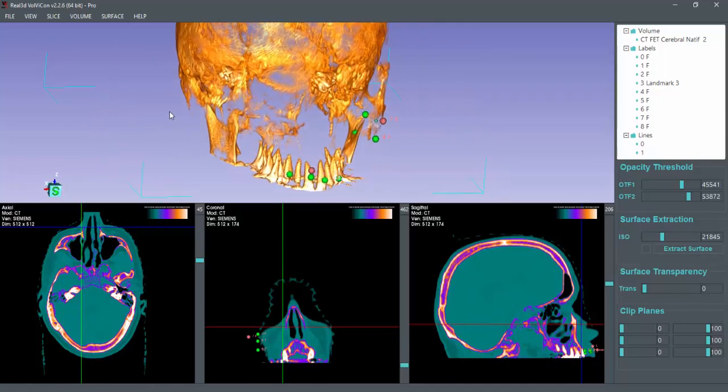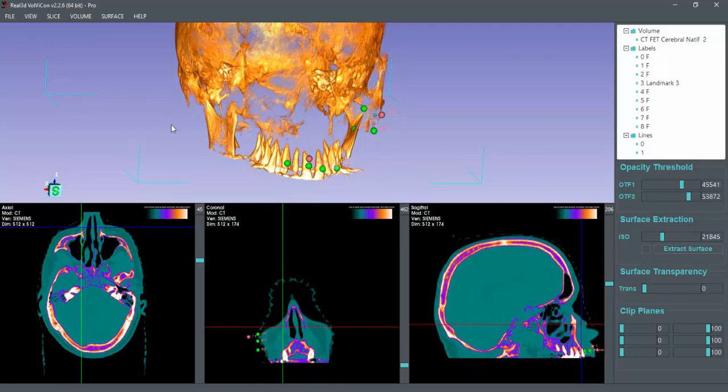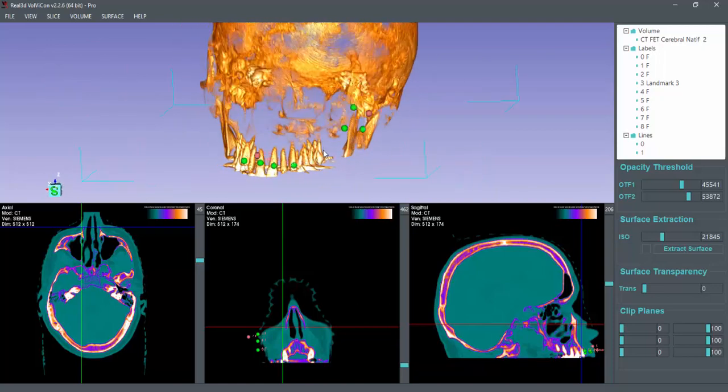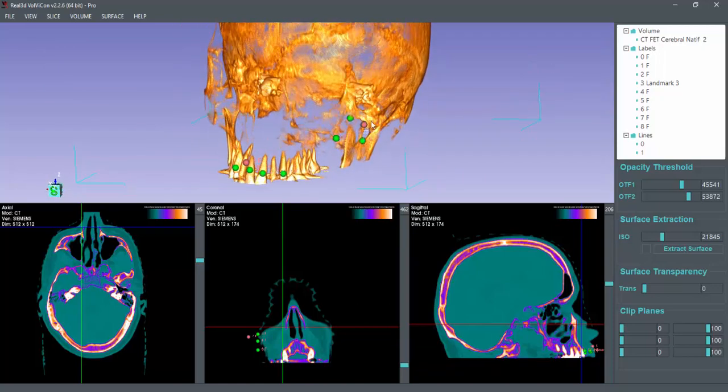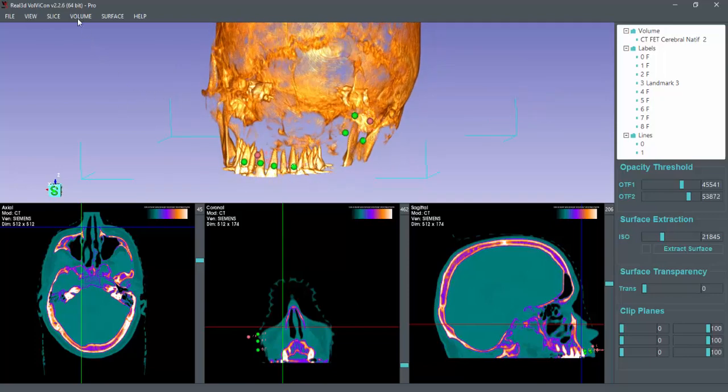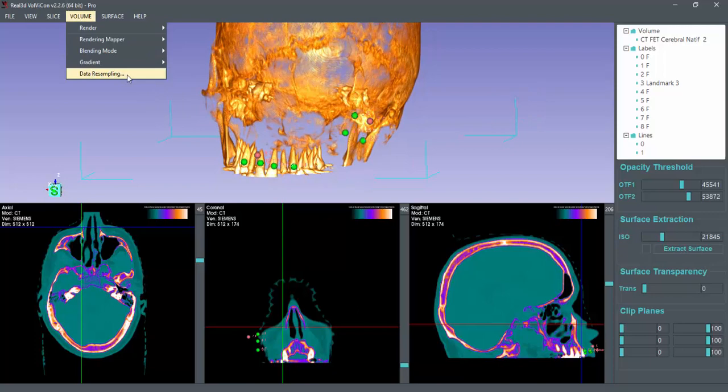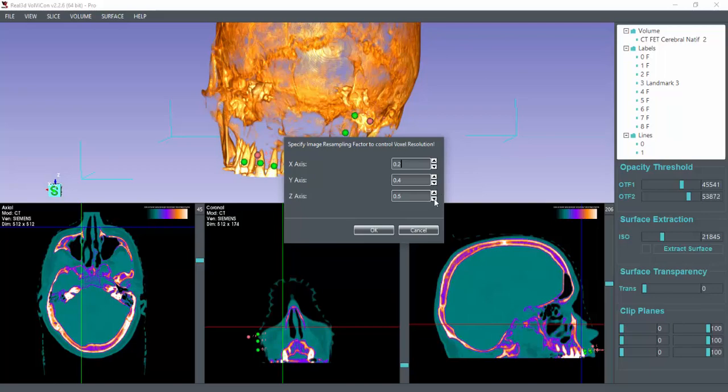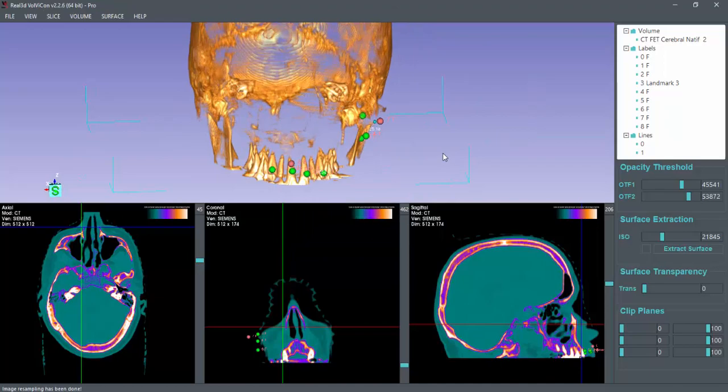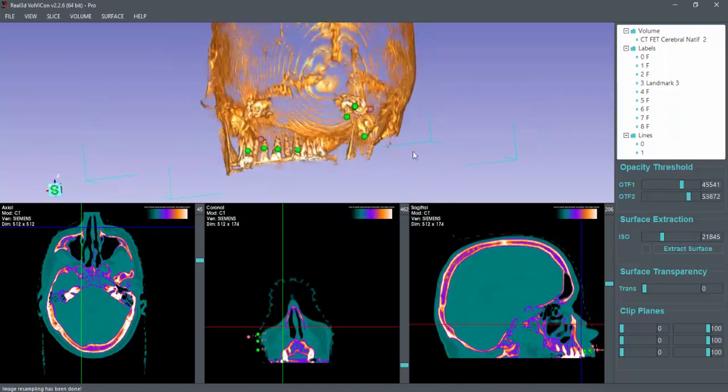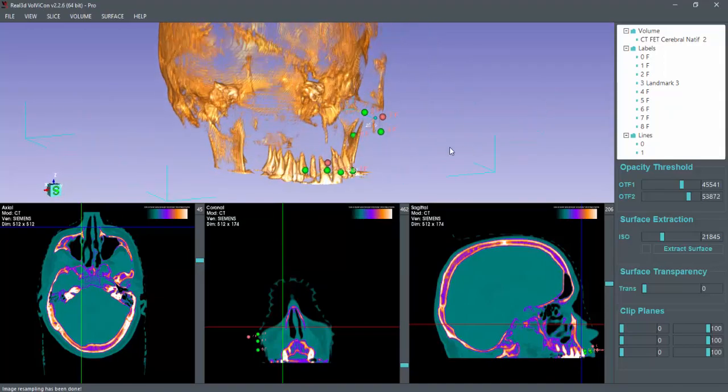If you have very big data, for example, the number of slices are in thousands, then you will feel like a little slow rendering or maybe low FPS on your machine. So what you need to do is data resampling. If your data is really big, you need to reduce the number of voxels just for rendering. You can reduce in XYZ, maybe uniformly, and you need to press OK. Then you will feel the speedup and faster rendering, and you can add points and these kinds of things very easily.